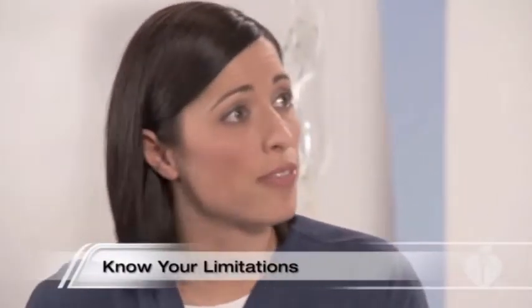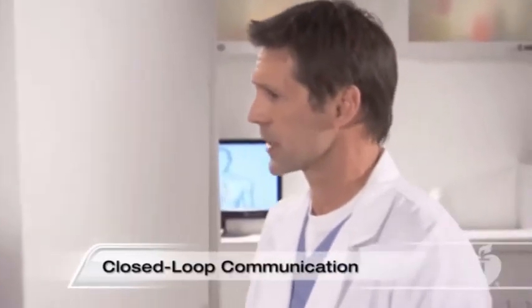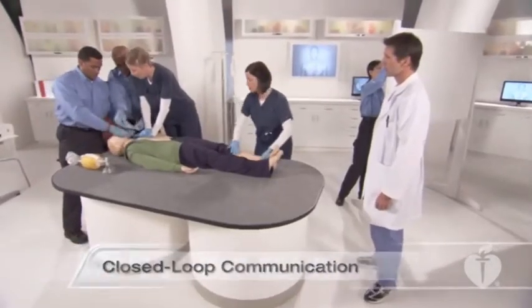Dana, have you been able to establish an IV access yet? I've tried several times, but it's failed. Okay, let's move on to IO access, please. Moving to IO access.